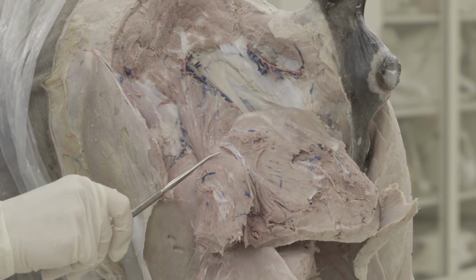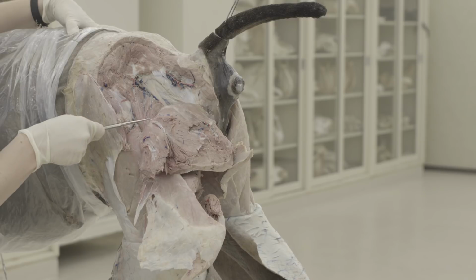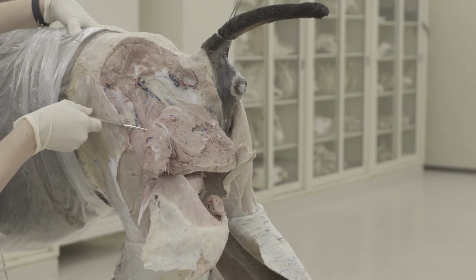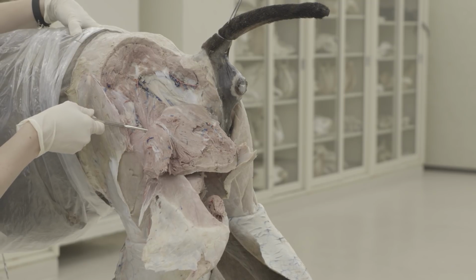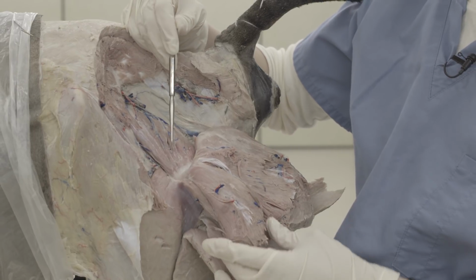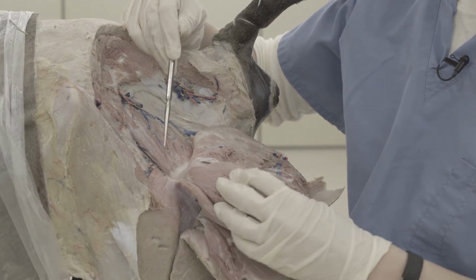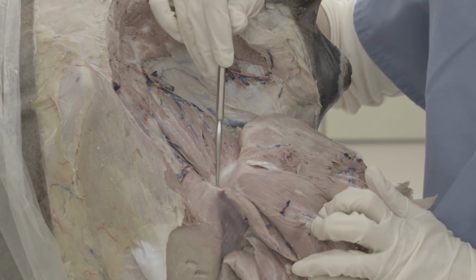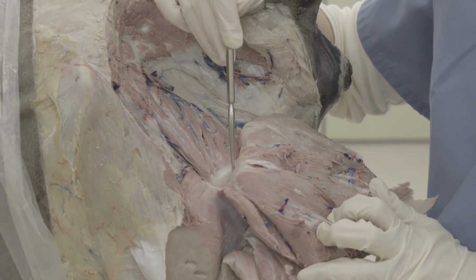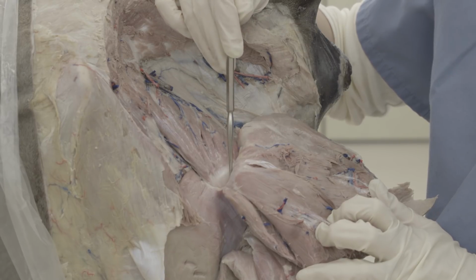In between your accessory gluteal and the greater trochanter, you have a trochanteric bursa. So that's where the probe is sitting inside. And we'll take a little bit of a closer view of that. So here we'll take a little bit closer up view of that trochanteric bursa that I mentioned. So here is that accessory gluteal, and in between the accessory gluteal, the tendon of it, and the greater trochanter, you have this trochanteric bursa. So basically a fluid-filled pocket here, protecting the bone. So here would be the trochanteric bursa where the probe is.